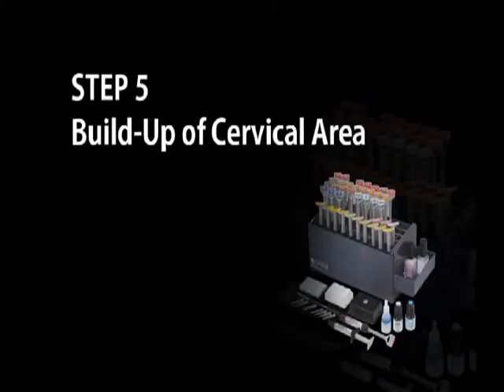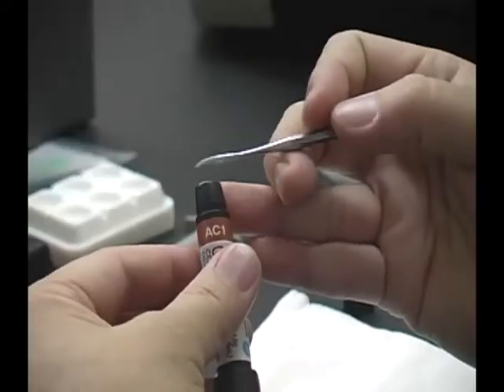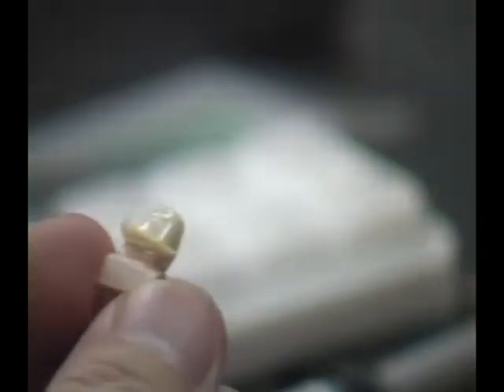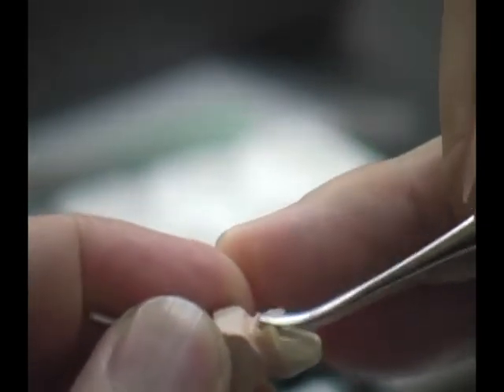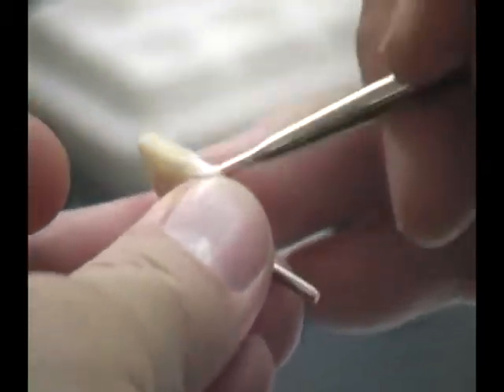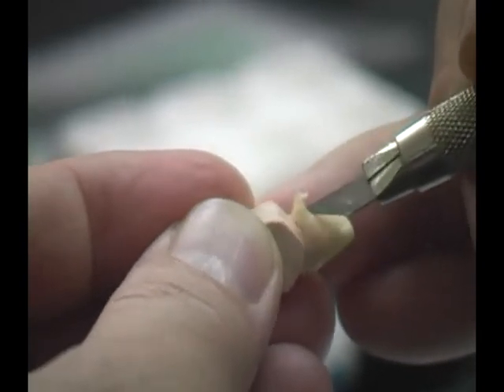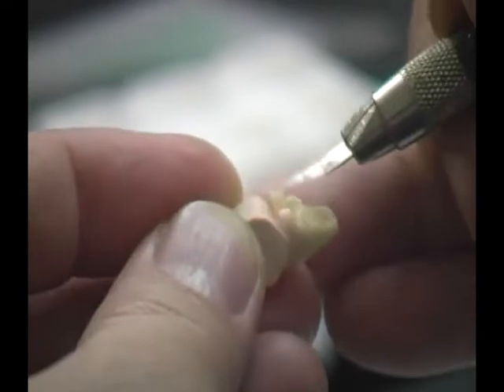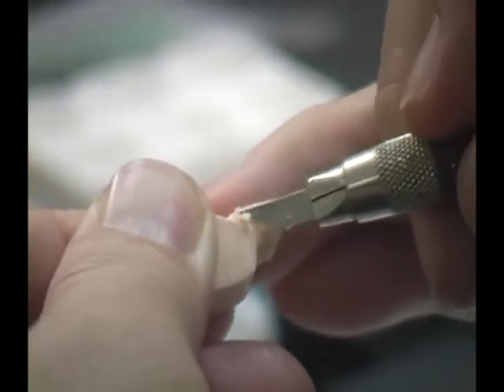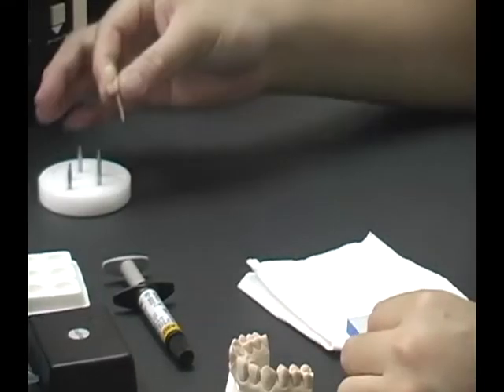Build-Up of Cervical Area. We will build up the cervical area by selecting AC1, designed for A2 shade. Syringe the required amount and apply over the cervical area, pressing gently to avoid air bubbles. Use a brush with modeling liquid to smoothen the surface. Apply on the lingual area in the same manner, then smoothen with a brush. Remove the excess from the margin with a cutting knife. Once the cervical build-up is complete, place the die on the tray and light cure for one minute.